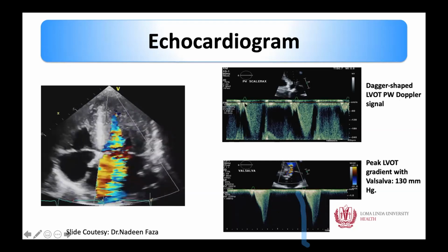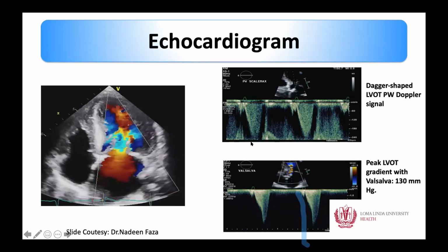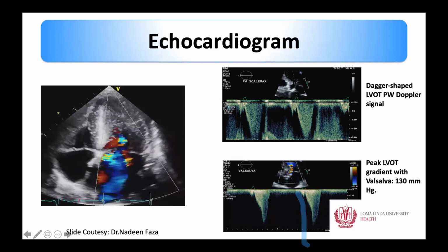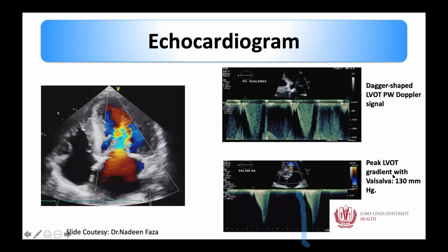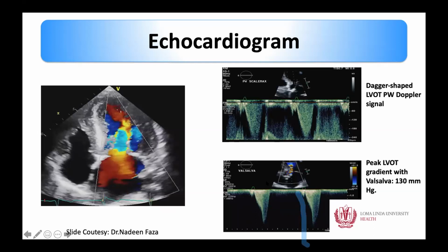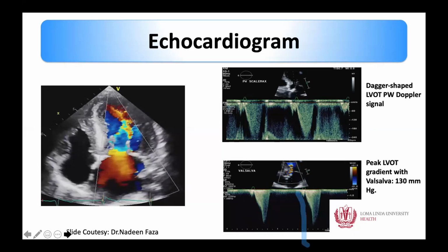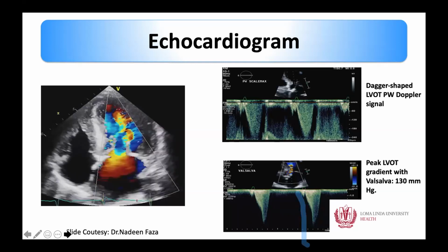So here is an example of pulse wave Doppler. Depending on how much the obstruction is, it may not be able to cover it in that Doppler range. And here is the continuous wave Doppler. With Valsalva, it can go up further. So you stay in this view, which is typically a 3-chamber or a 5-chamber view in the apical segments, and then you try to see what the pulse wave as well as the continuous wave Doppler is.